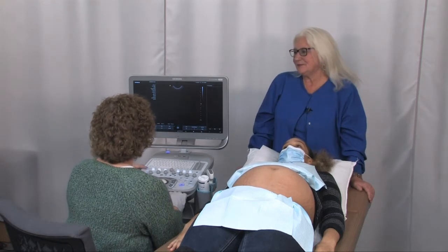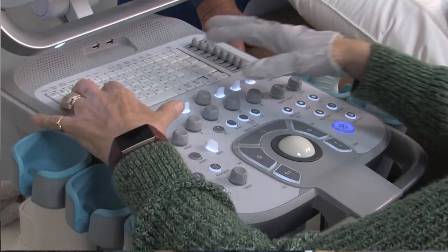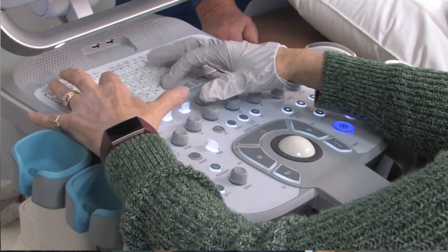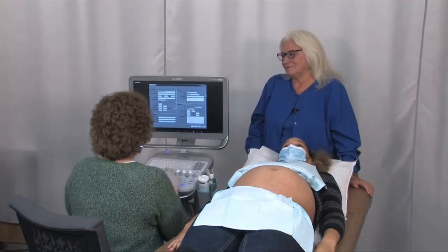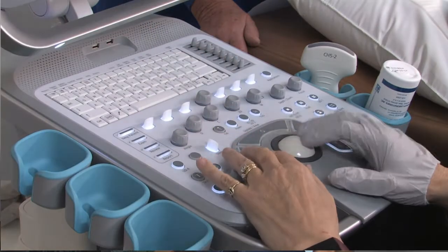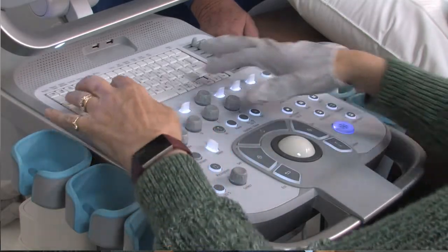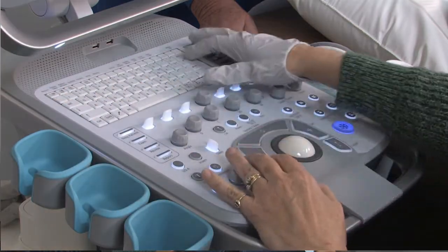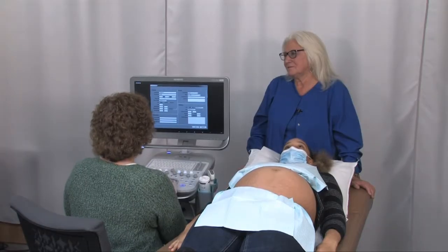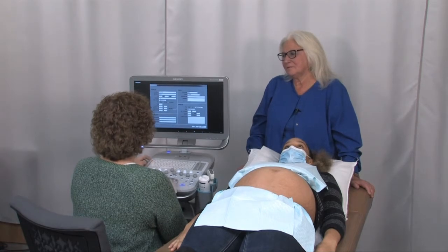So the first thing we're going to do is hit new patient. And we're not going to use her real name. I'm just going to type in Siemens baby. So last name, you can come down and use the tab key if you want and do the first name. And I already put baby up there. So let me just get rid of this. And then down here, we'll tab and put in patient ID.